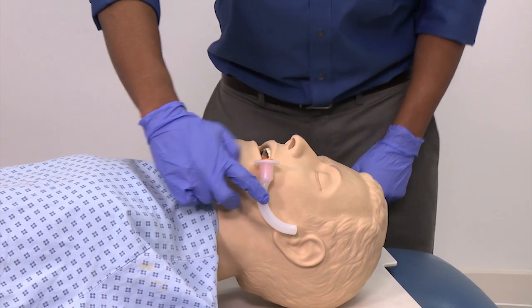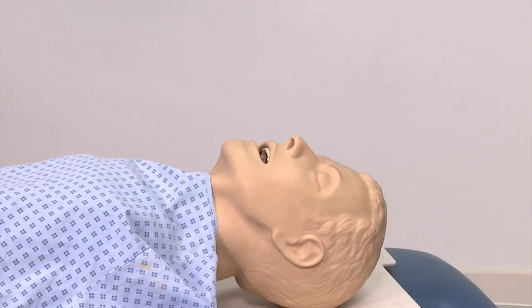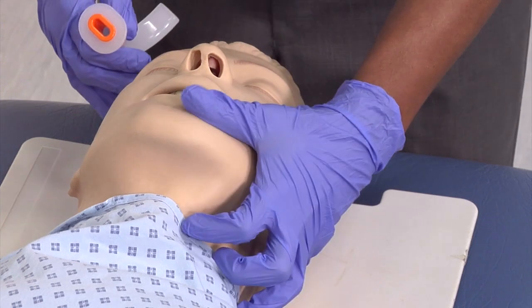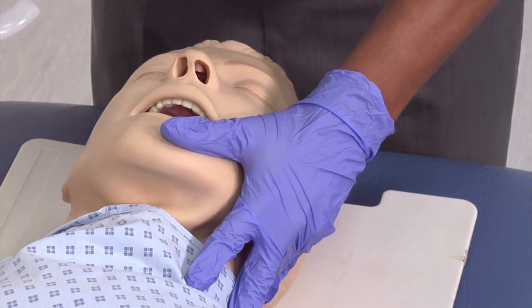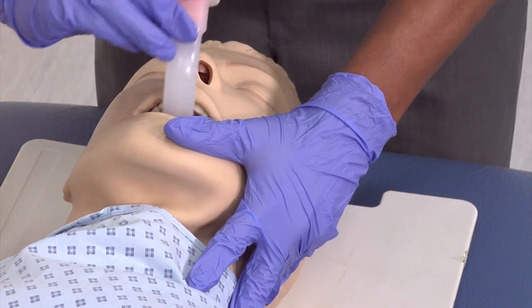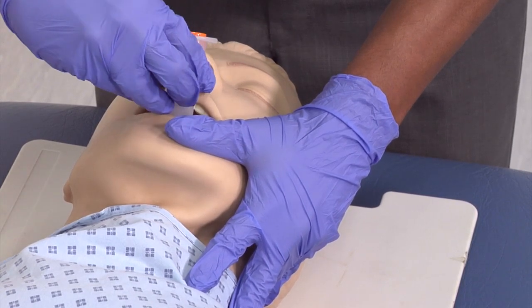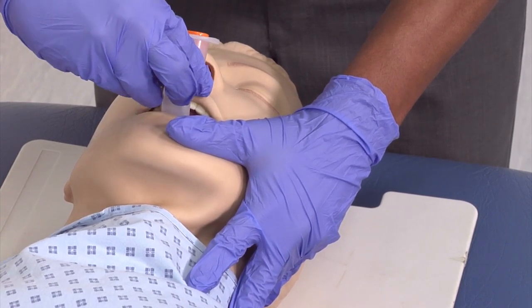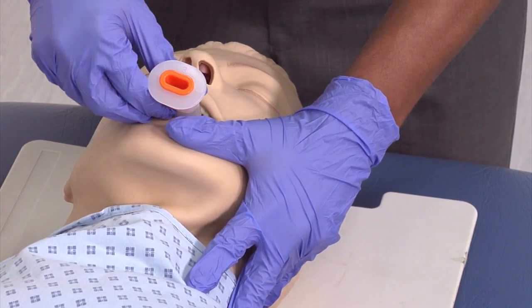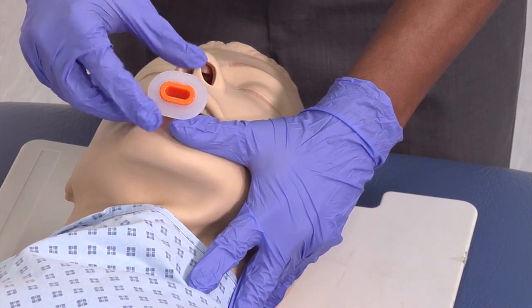Approach the patient's head from behind the bed. Open the mouth and insert the Guedel upside down with the tip pointing upwards. When you feel the tip touching the back of the throat, rotate the Guedel 180 degrees to leave it in the correct position.